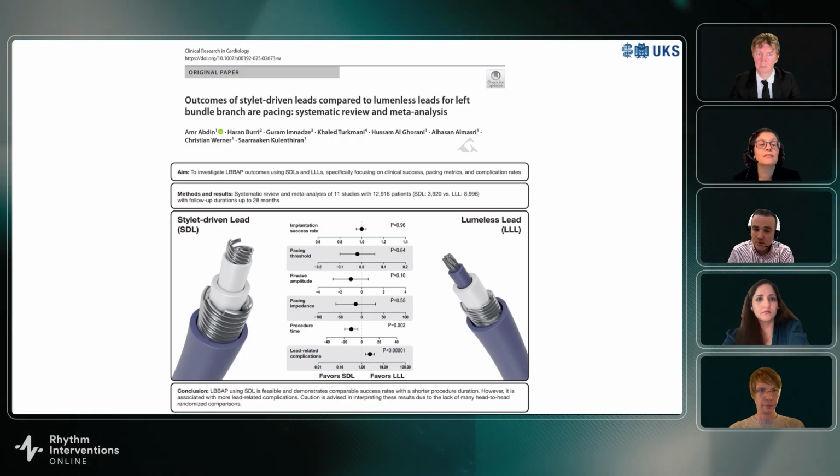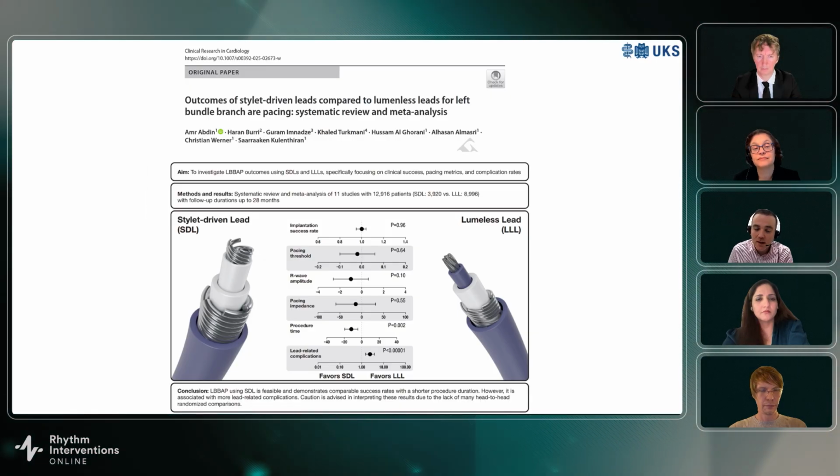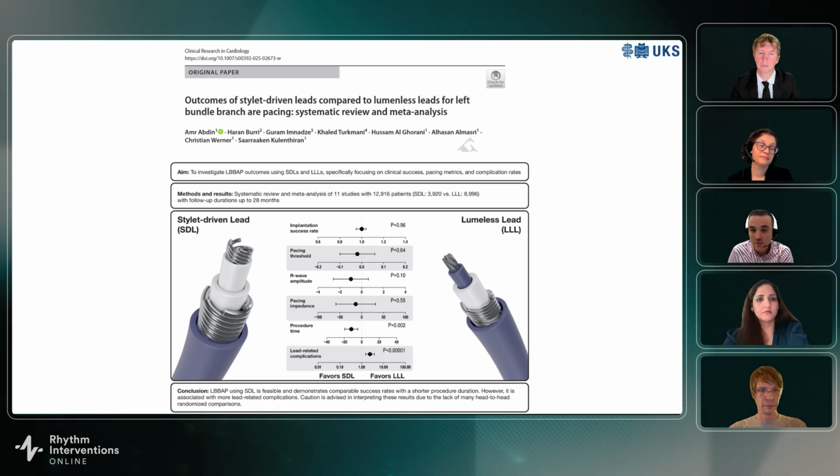And just to the question, which lead should I use? Should I use a stylet-driven lead or a lumenless lead? We don't have even one randomized control trial that compared the two strategies, but I will show a meta-analysis we performed, which included more than 12,000 patients.